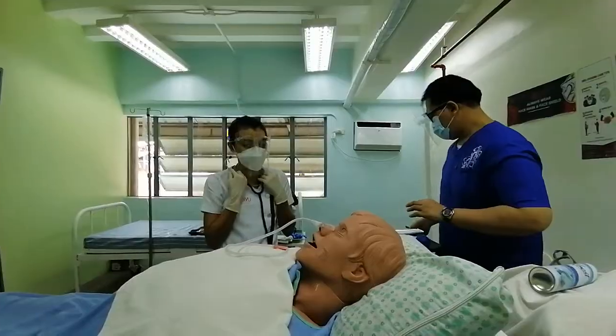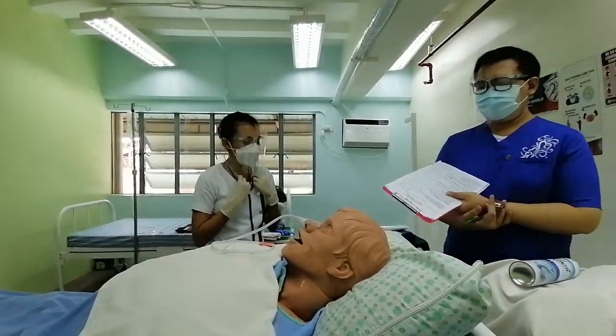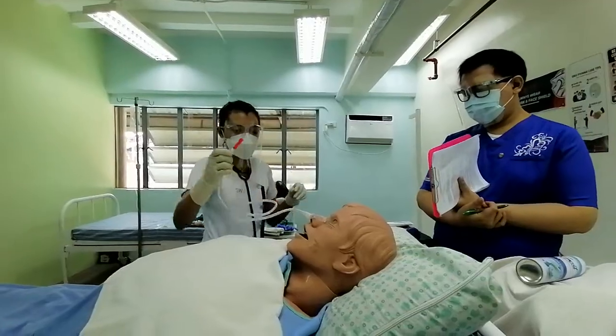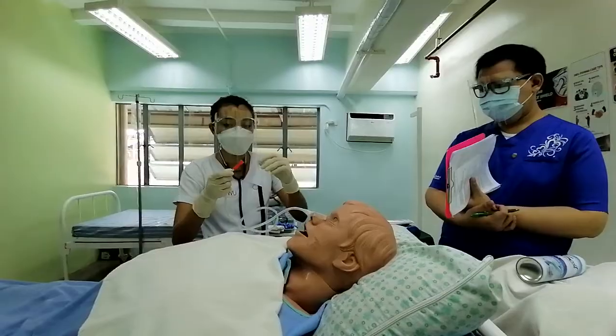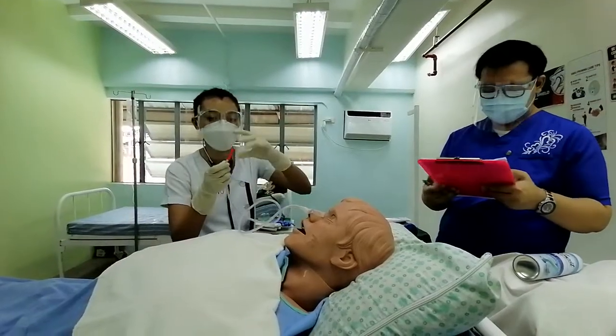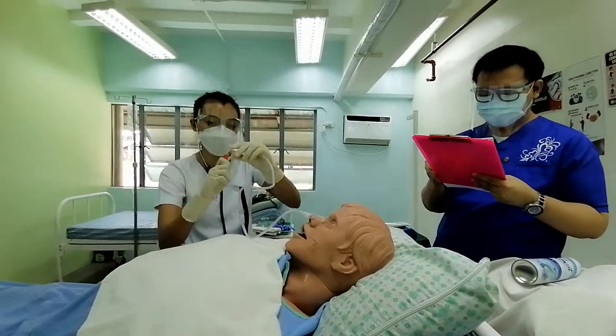So I will check for the placement of the tube. When checking the placement of the tube, the first check is to insert 10 cc of air and check for the gurgling sound.